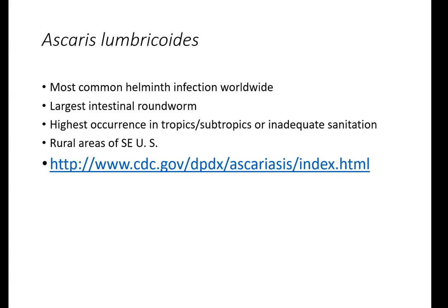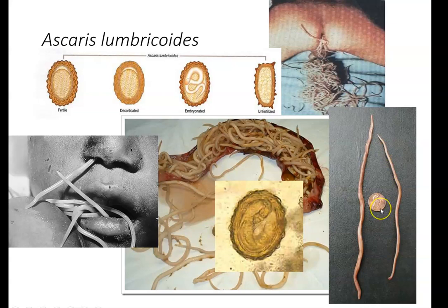So this is a penny. I have Ascaris in a little block that you guys can see, the male and the females. You can't really see on here, but this guy here has a little hook on his end. He comes out and he has a little curve to the end. And that's typically how you can tell the difference between a male and a female.